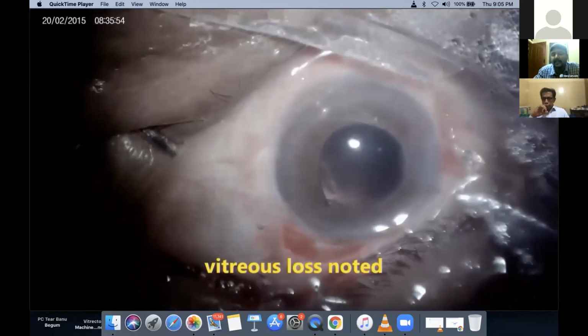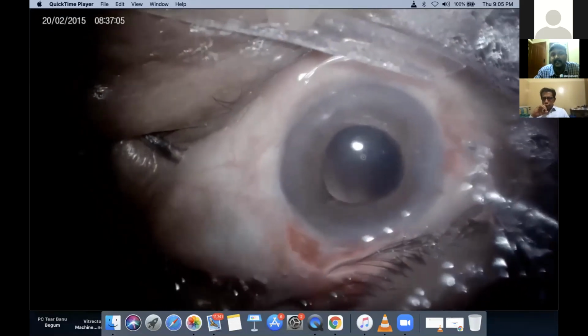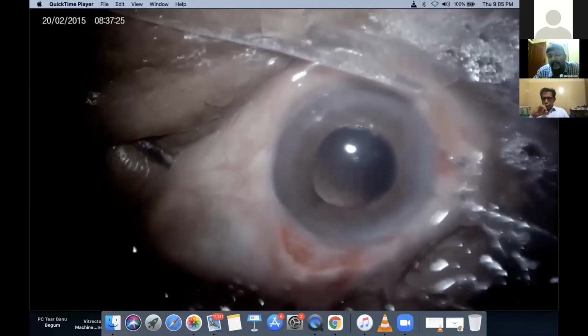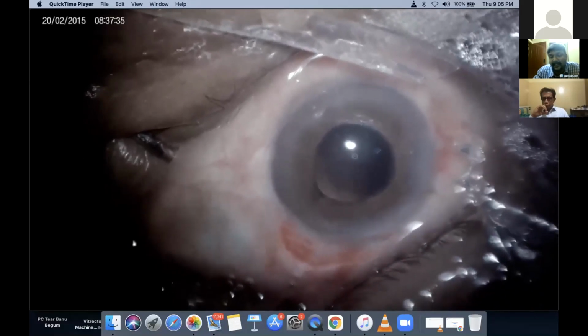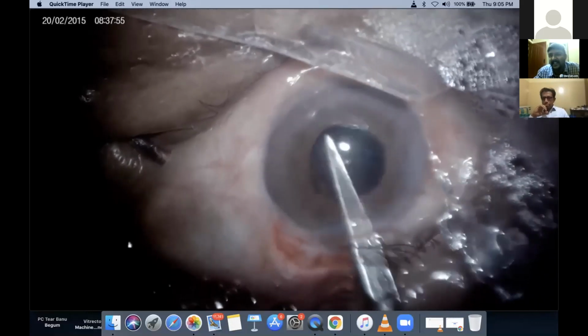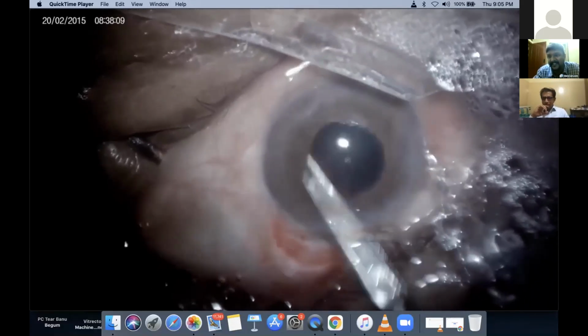So this is what you're seeing: the IOL was removed, and the vitreous loss was seen. My vitrectomy probe was not working that particular day, so I went ahead and did an anterior vitrectomy with Vannas. The video is played very fast, so it is not that speed that I have tried to pull the vitreous in. It looks very scary when you see that happening there.